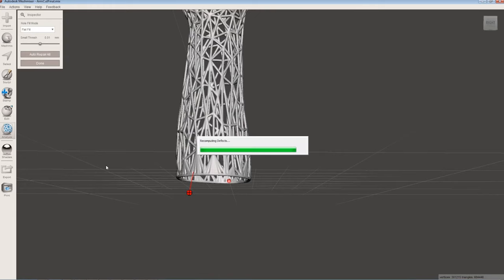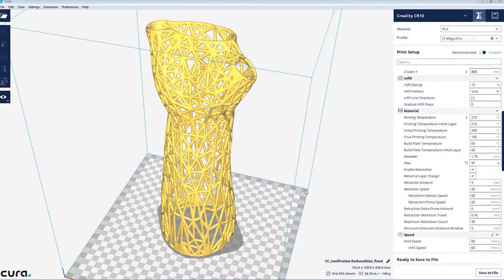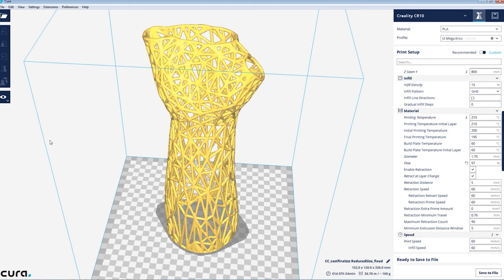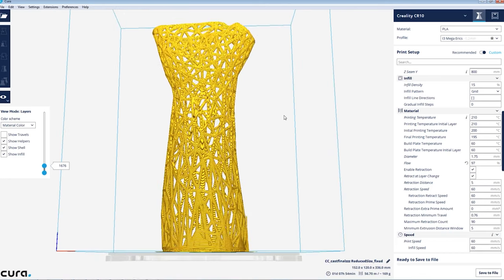In the first stage, the X-ray stage, a standard X-ray of the patient's limb is taken to determine the exact position of the broken bone. The second stage is 3D modeling. Here, the patient's hand is scanned with a 3D scanner to create a 3D model of it. The 3D scanning and subsequent modeling is based on the exact measurements of the patient's hand. This allows a perfectly fitting impression to be made.